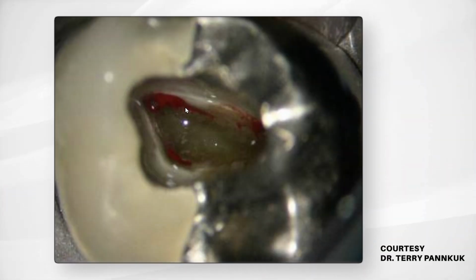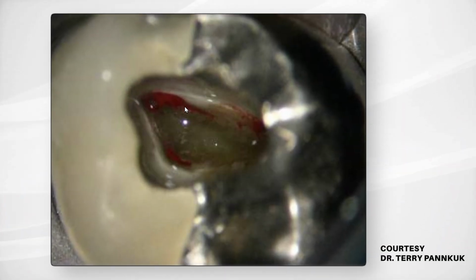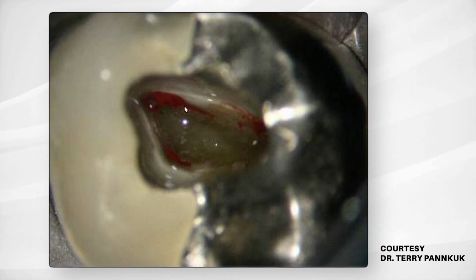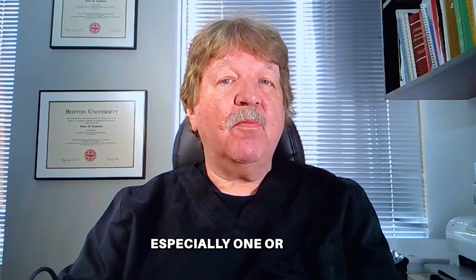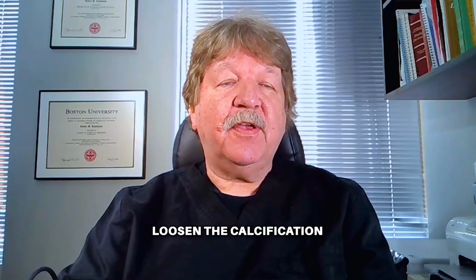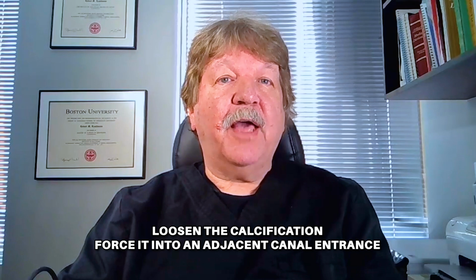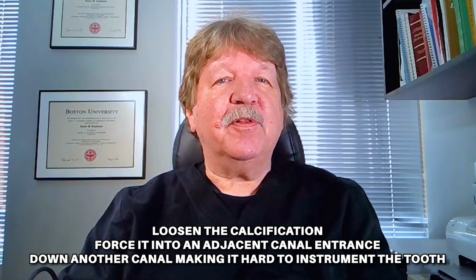Secondary dentin deposition in the chamber tends to be more clear in color and has been described by some clinicians with the appearance of glacial ice. They are best removed with ultrasonics or explorers rather than a burr, especially if one or more of the orifices has already been opened or instrumented. Using a burr can sometimes loosen the calcification and force it into an adjacent canal entrance or down another canal, making it hard to instrument the tooth.